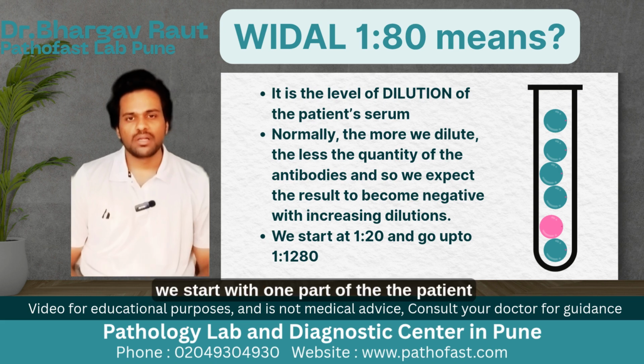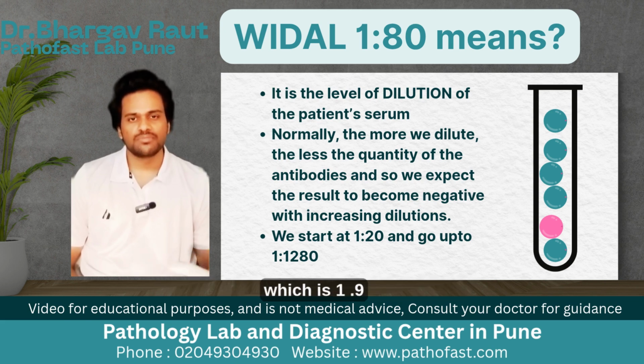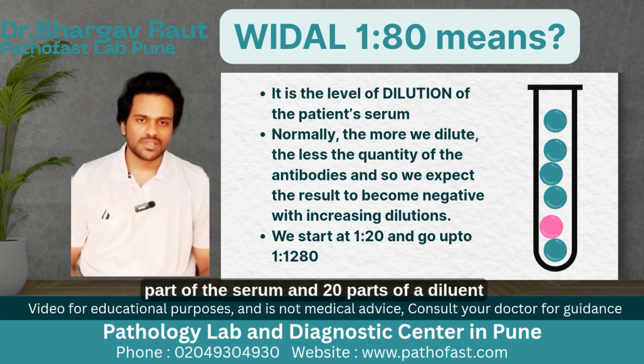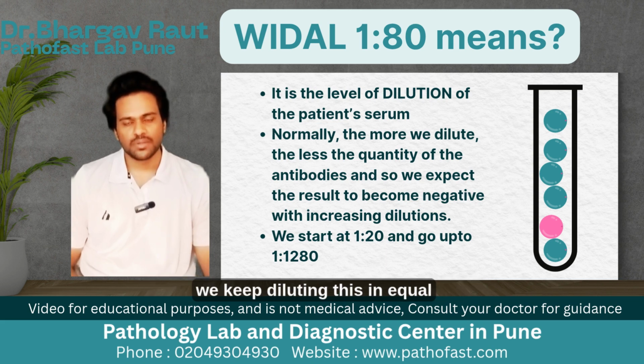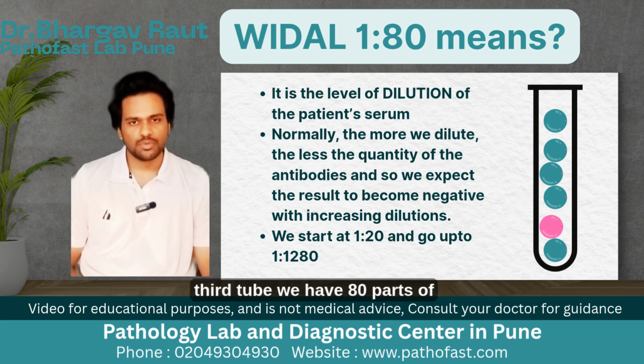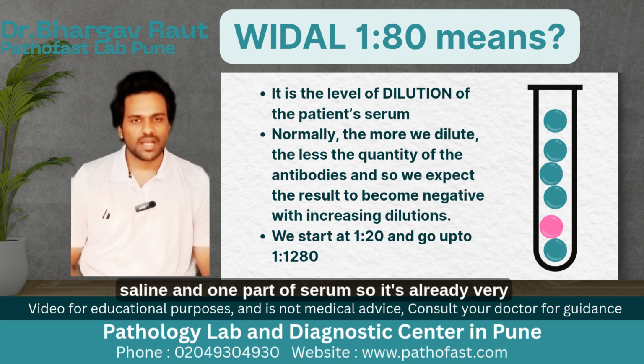We start with 1 part of the patient's serum, which is like 0.1 ml, and we use 20 parts of saline, which is like water, which is 1.9 ml. So to begin with, we have 1 part of the serum and 20 parts of a diluent. We keep diluting this in equal quantities every time, so that by the time we reach our 3rd tube, we have 80 parts of saline and 1 part of serum. So it's already very dilute.